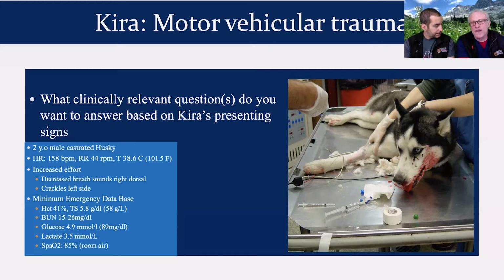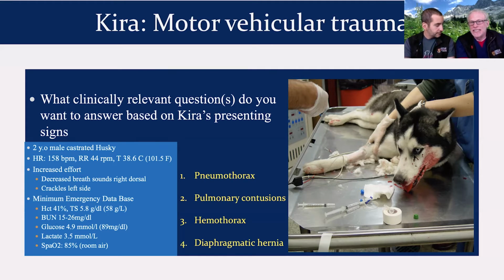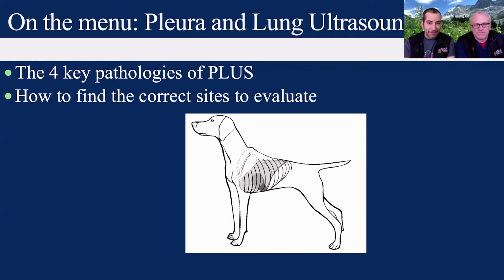Hemothorax. Not as common in our veterinary patients because they usually, unfortunately, if they have significant hemothorax, they won't make it to the hospital, unlike our human counterparts where they get a greater degree of on-site stabilization. Yep. Our veterinary patients, unfortunately, they don't often make it, but hemothorax is on the list along with diaphragmatic hernia. Yeah, 100%. So those are the top things we think about, those clinical drawers that open. And the cool thing is, Dr. Boysen, point of care ultrasound, we can look at this. Now let's talk specifically today about pleura and lung ultrasound plus point of care ultrasound.